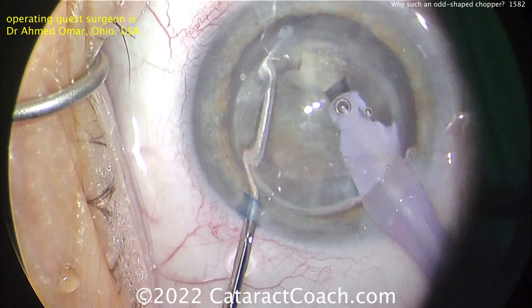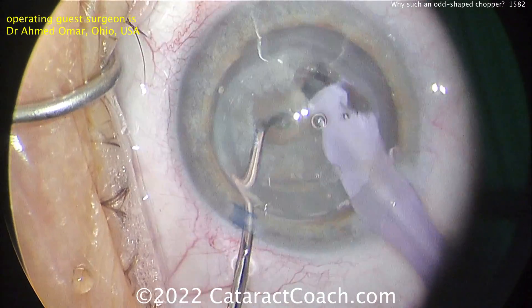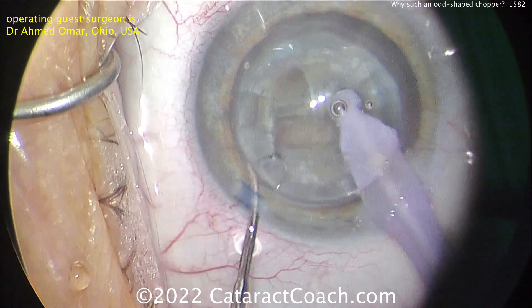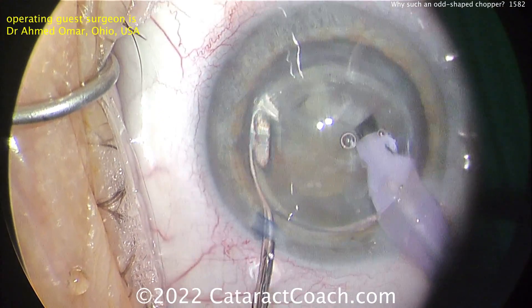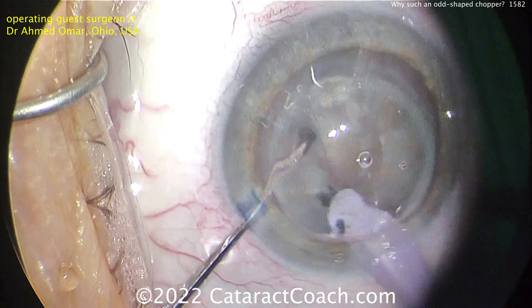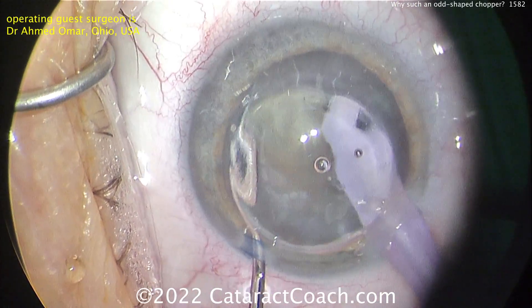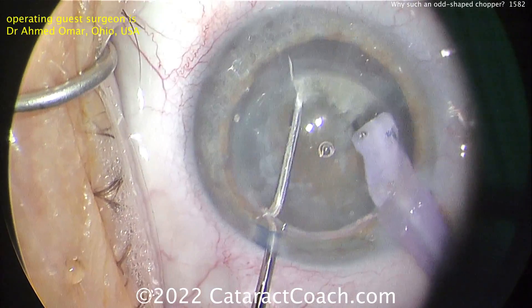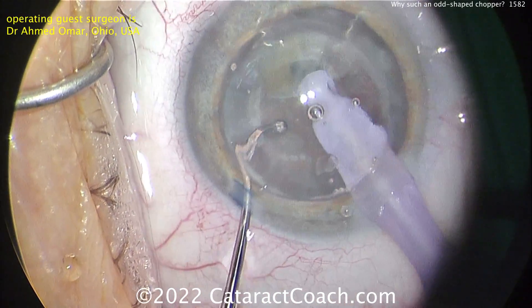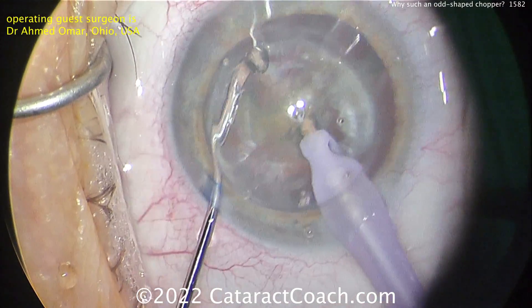A couple of important pearls here. If you're going to do cataract surgery on a patient with a prior cornea transplant, number one, let's talk about lens calculations. How are you going to measure the cornea? Do your usual topography, tomography, and keratometry, and see what you come up with. But of all the devices you use, look carefully at the central three millimeters of the cornea — that's what's most important. In that zone, figure out what's the lowest corneal power. Use that for your lens calculations.